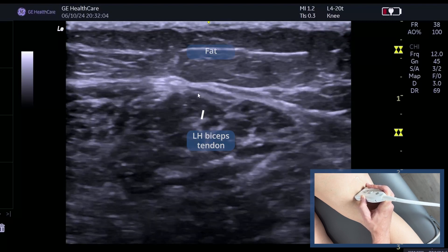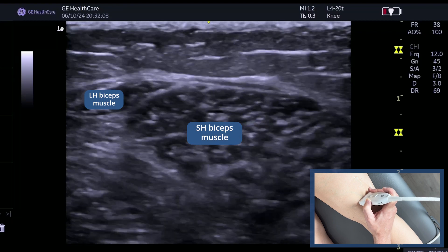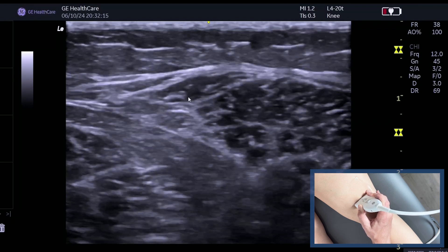Now we can see here the tendon of the long head forming, and as we come down this is going to be the short head. I've got my frequency quite low because obviously it is going to be quite deep in the back of the leg, and this is the end of the long head.